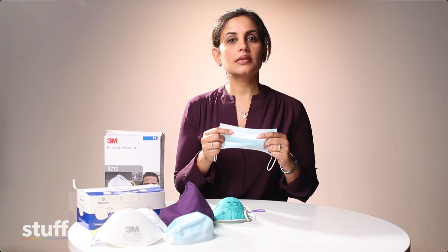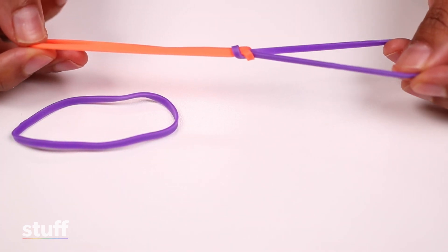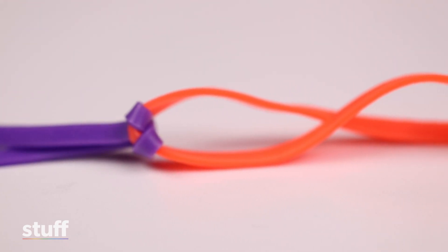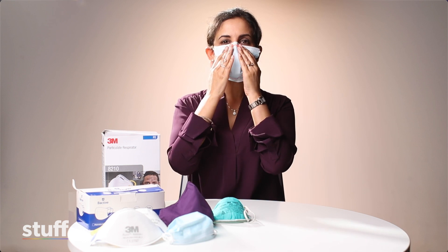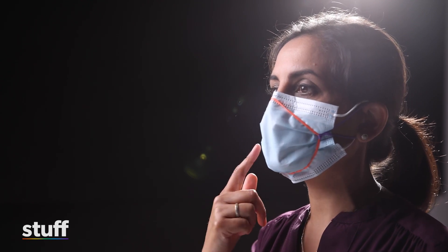The second mask hack I'm going to show you is tightening the fit of the mask by using a three rubber band brace. You take your mask and put it on. Then take your rubber band brace, stretch the middle band over your nose and your chin, and take the loops and place them over each ear, making sure that the knots of the rubber band are over the top of the surgical mask. Then mould the mask down and make sure that the rubber bands are sitting comfortably around your face. As you can see, the mask is moving in and out with my breathing and providing a much tighter seal and better fit.